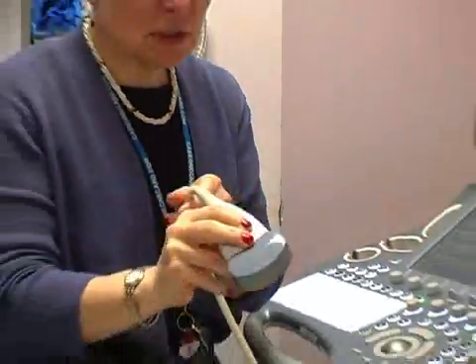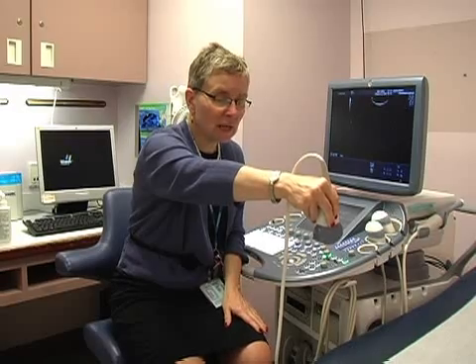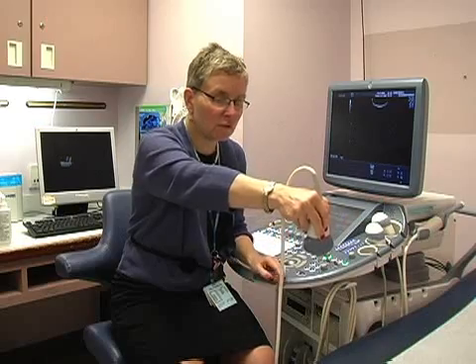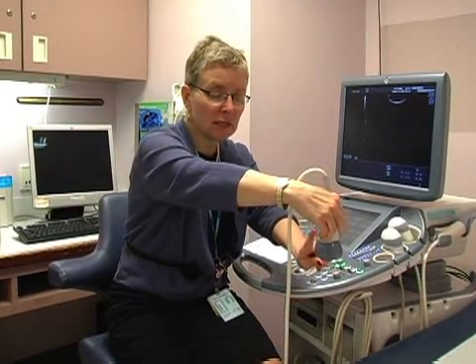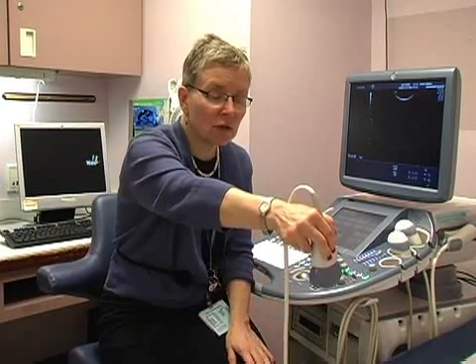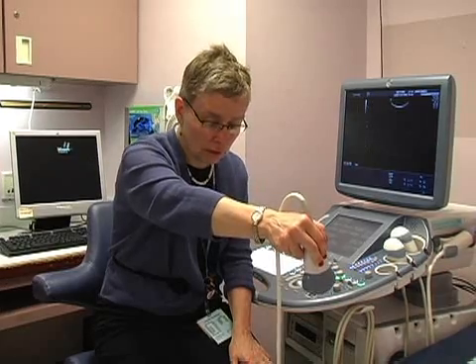When orienting the probe and scanning in the sagittal position, the notch should be up toward the patient's head. This would be a sagittal view of the patient, and the notch is toward the patient's head, not toward the patient's foot. When you're scanning in the transverse position, the notch goes toward you or on the patient's right. Correct orientation of the probe and standardization of images is important to identify fetal parts and also to orient the reader to the images you're taking of the fetus.